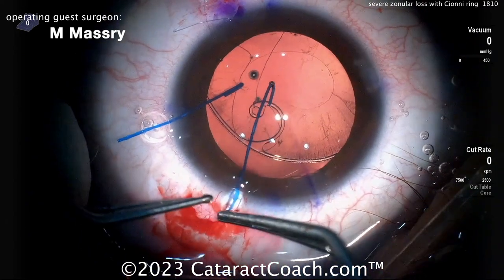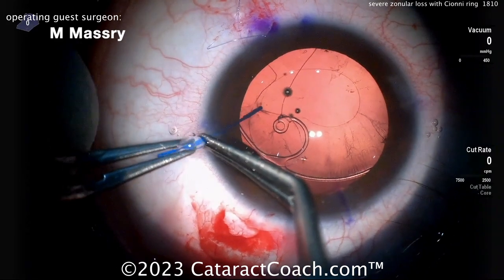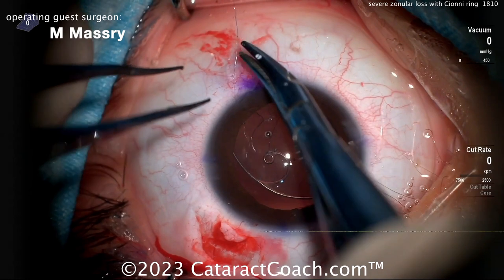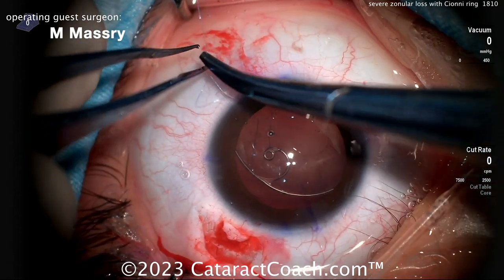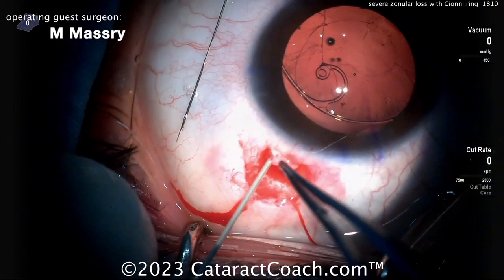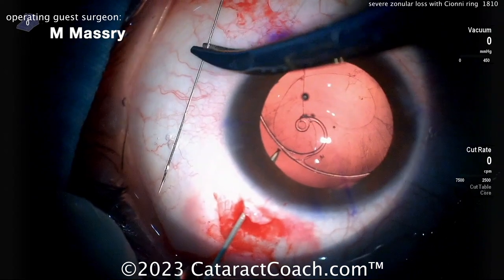Now you can get rid of those two hooks. Take those out. Now you're going to pass a needle with the other end of that 10-0 suture material on it — so it'll be a 10-0 prolene. The 10-0 should last very well. The smart move here is the surgeon hiding it underneath that scleral flap, using a hollow-bore needle to help guide it.